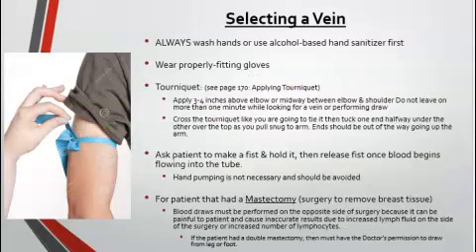Okay, this next slide is on selecting a vein and completing the venipuncture. The very first thing you want to do is to wash your hands really well, or to use an alcohol-based hand sanitizer, and then you want to put on your gloves. Of course, you want to select properly fitting gloves.